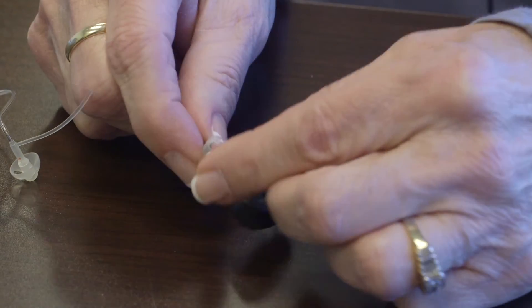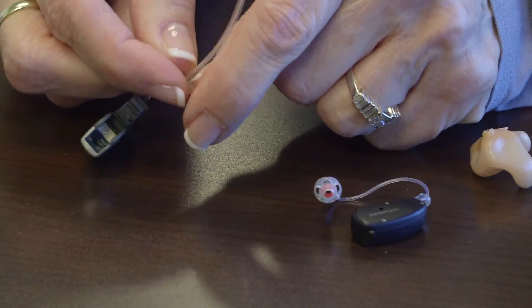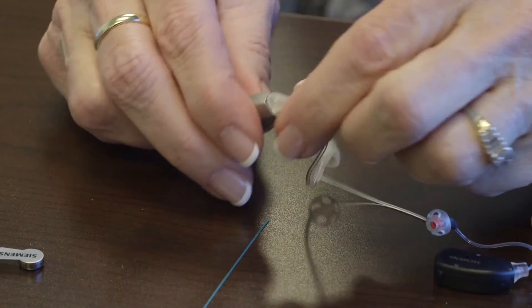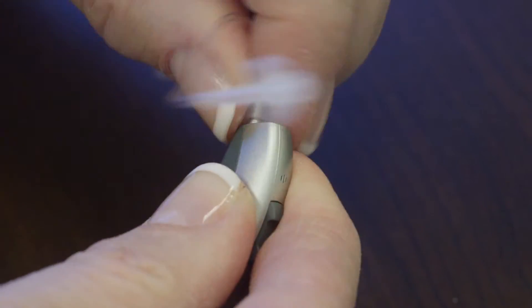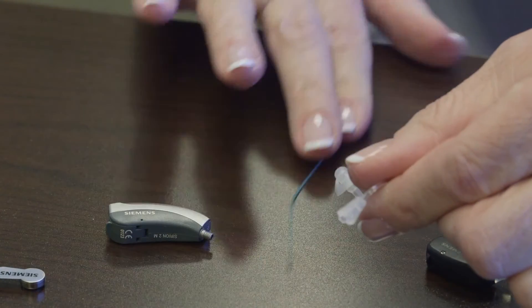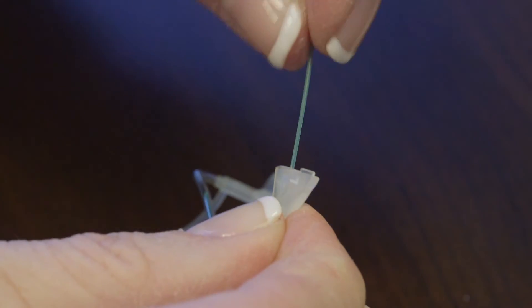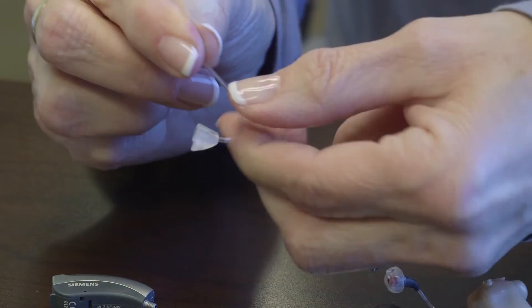Most hearing aids can be cleaned by simply wiping them off with a clean cloth, taking any skin or wax off of the device. You can clean the little dome with a damp cloth to remove any wax or skin that might be interfering with transmission. If you get wax deeper in your thin tube, then we use a special cleaner — unscrewing the tubing at the top of the hearing aid and passing the cleaner through the tube until it comes out the other end, pushing any debris out, and then reattaching.